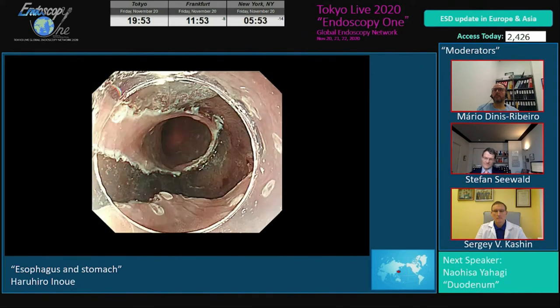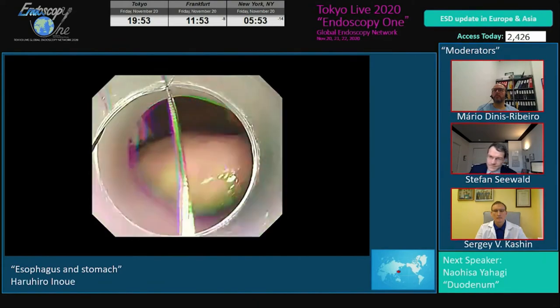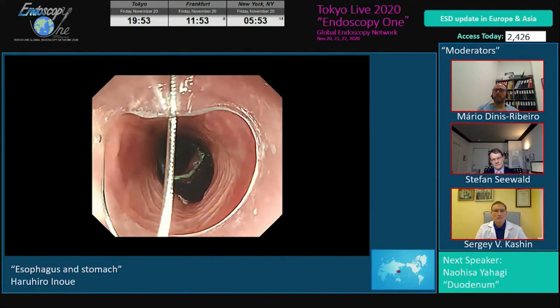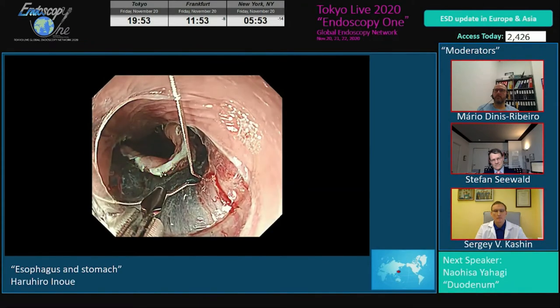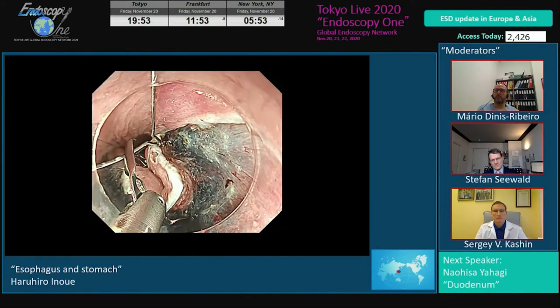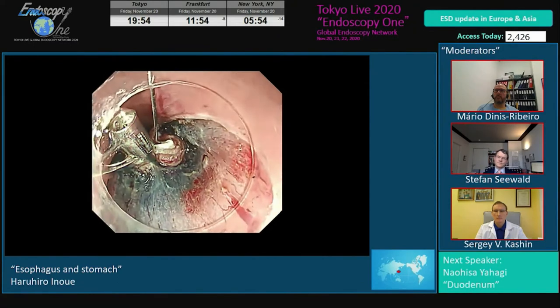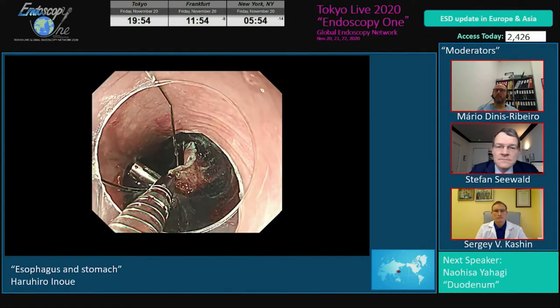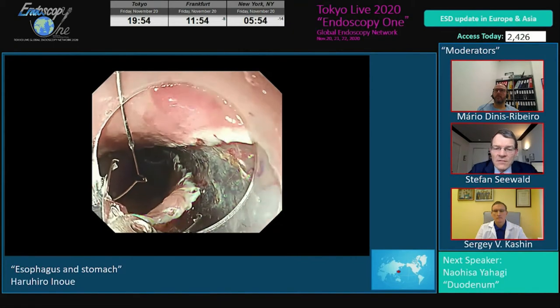The circumferential mucosal incision was made. And then now we catch the snare wire with the disposable clip through the channel, then bring it to the place. And then we are trying to fix the snare wire onto the proximal edge of the specimen, first clip. Then we place a second clip. Now we are inserting the second clip and then placing the second fixation onto the right wing of the specimen.